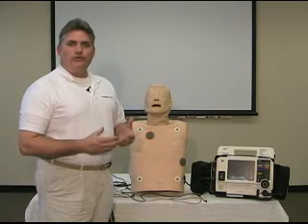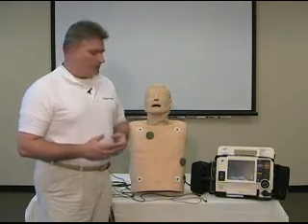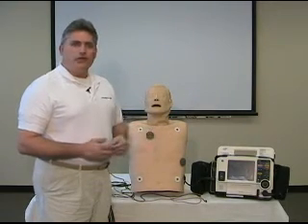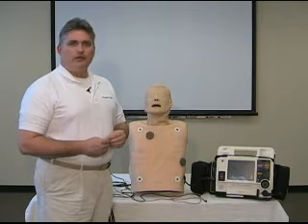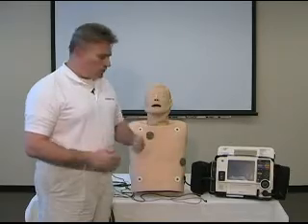Let's first start with limb leads. Limb leads are 1, 2, 3, AVR, AVL, and AVF. And those are acquired by the 4 standard leads. We call these limb leads because traditionally they're placed on the limbs of the patient. But let me caution you that for a true diagnostic 12-lead EKG, those limb leads need to be placed on the limbs and not on the torso like we so often do. I'll demonstrate, but with our mannequin here, obviously I can only put them on the torso.